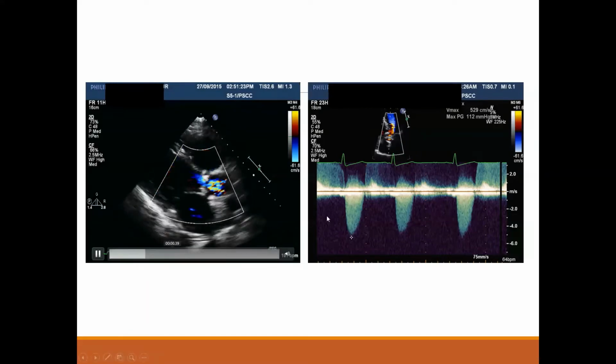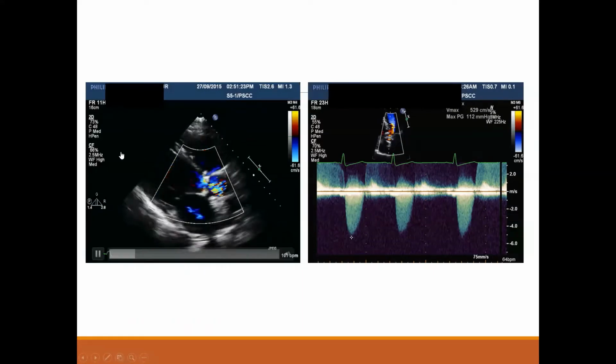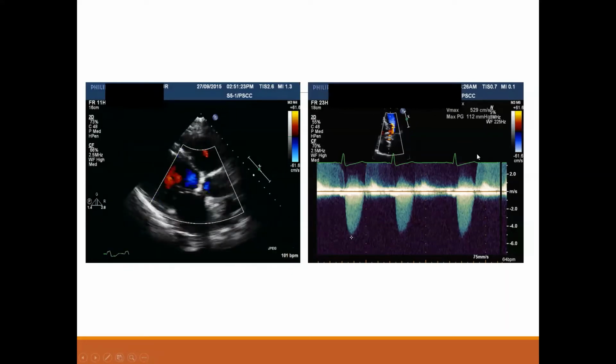The other view, the LV looks a little bit down. Ejection fraction seems reduced. Okay. The LA is a little bit dilated. For the other view, it is a 4-chamber view, sorry, 5-chamber view. Okay. With CW across the aortic valve, which is showing aortic valve velocity. It is more than 4 meters per second. Oh, more than, yeah. It's approaching 6 already.